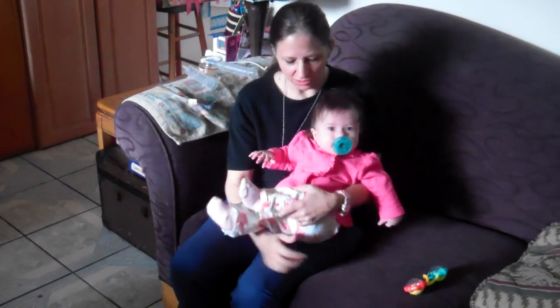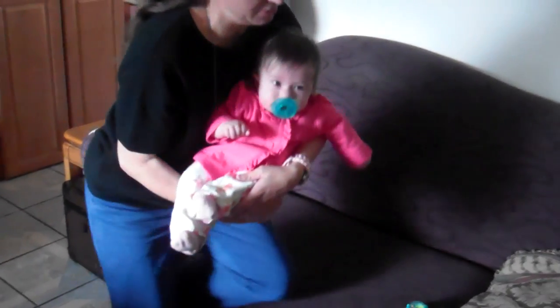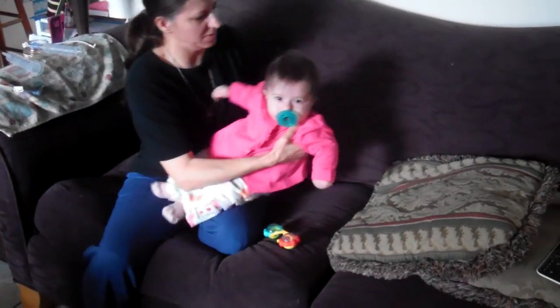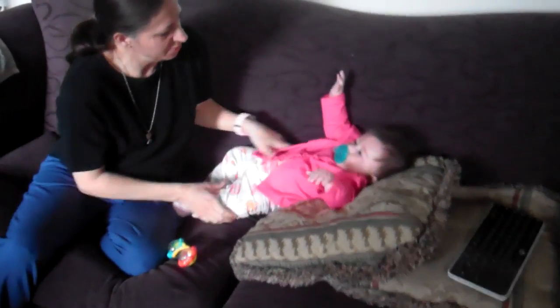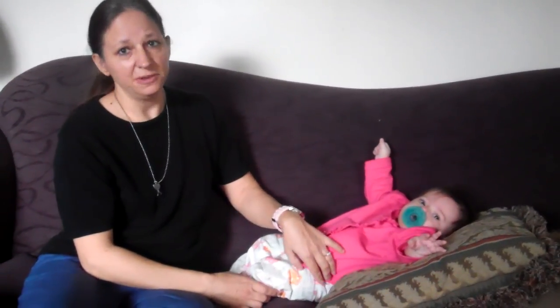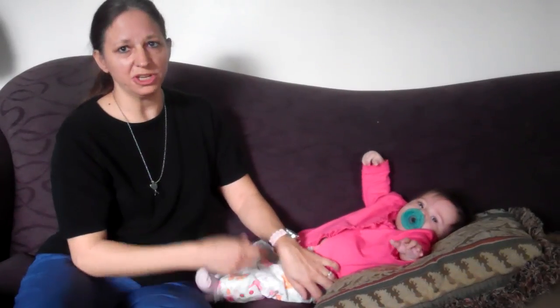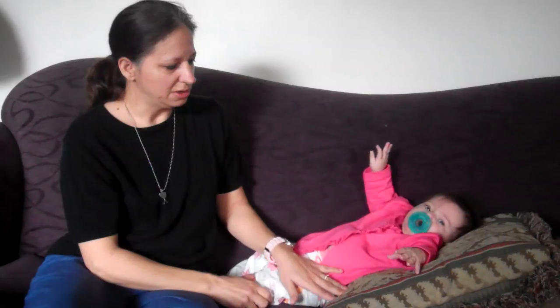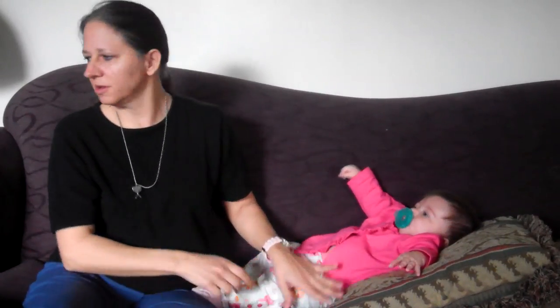So I'm going to just lay her down right here. I'm just going to put her right here. And sometimes I try to feed her while I'm holding her, but that can be a little bit difficult sometimes because she's getting older and she can pull on her tube, and we don't want her to pull it out of her tummy, and her hands are kind of everywhere. I'm just going to show you this way.